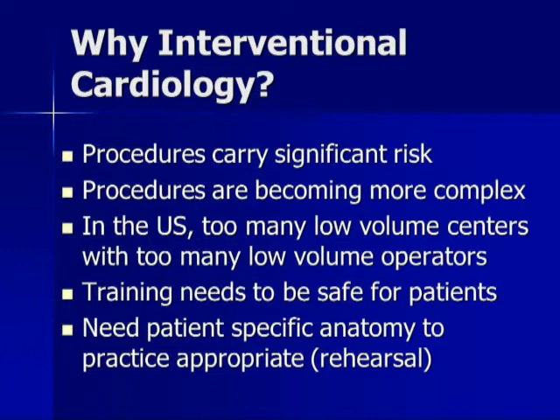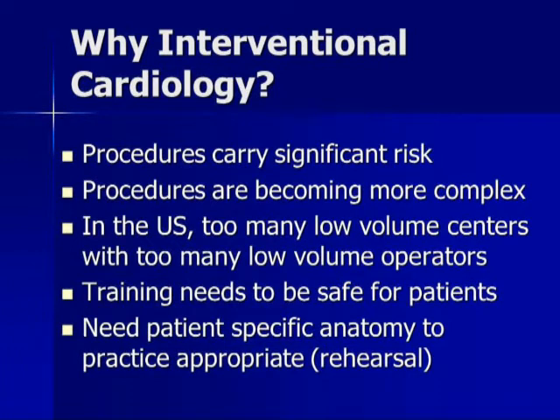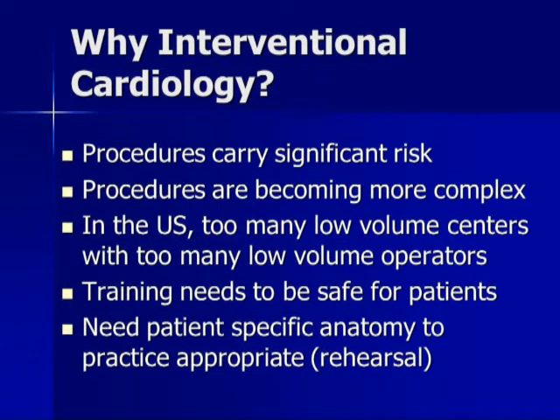We need to adjust a training program that fits our realities here in 2012 in the United States. The training does need to be safe for patients. The fact that you can do a complex procedure never having practiced it once outside of a patient is a little bit problematic. And then I think the thing that's the newest to this arena is the use of patient-specific anatomy. So if you come in for a complex intervention that myself or one of my partners is doing, it would be terrific if we could import all of the data for which you were exposed to contrast and radiation and rehearse that case before we get in and do your case, and do all the pre-procedural planning such that you can have plan A, plan B, plan C. You know the catheters you're using. You can minimize radiation and contrast to the patients. So this whole concept of rehearsal, I think, is really gaining huge traction in this area.